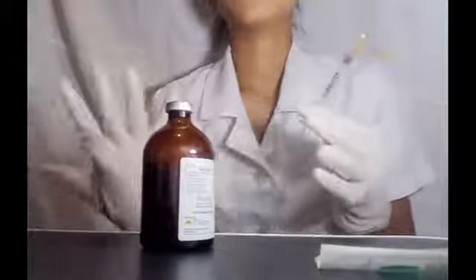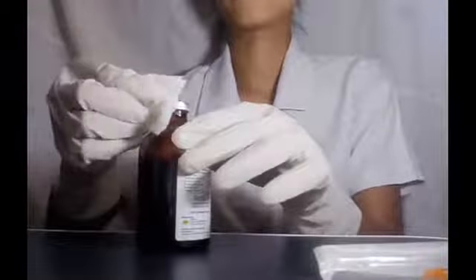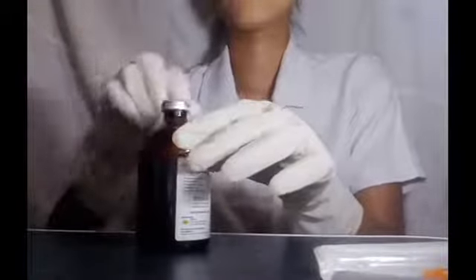First we will wipe off the cap with the alcohol wipe. And we're going to draw back our air.